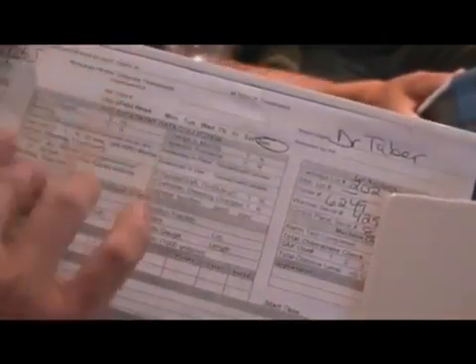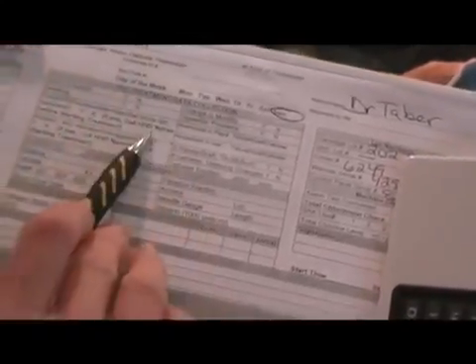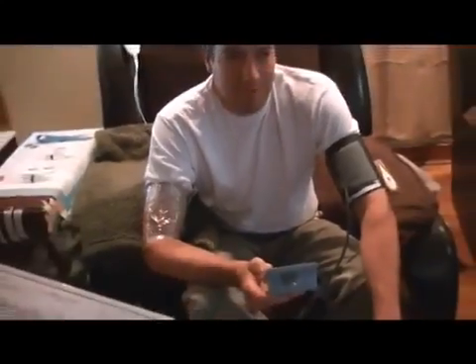And then this just tells our cartridge numbers and everything, so we know what's being used, and it asks questions like, are you short of breath, swelling, have you been to the ER, and we put what solution we're using, and that we're actually using the bags today, and that his fistula, you can hear and feel the thrill and the bruit. So 146 over 93, 92.